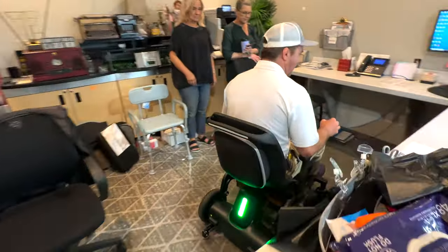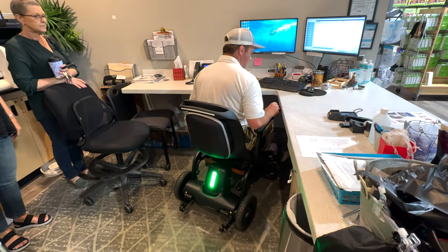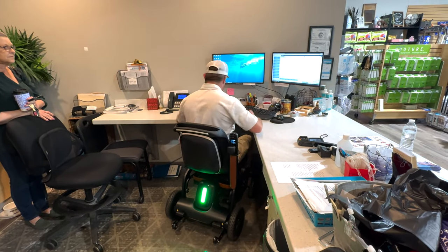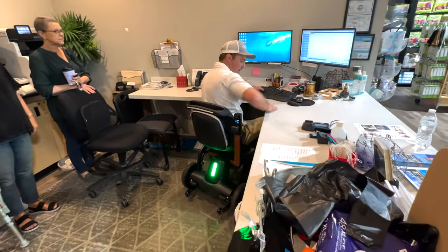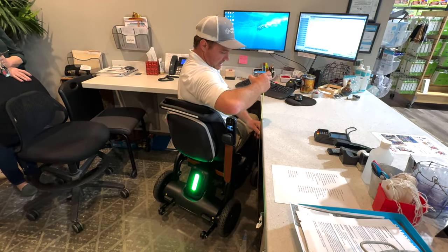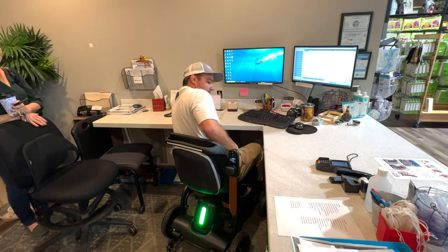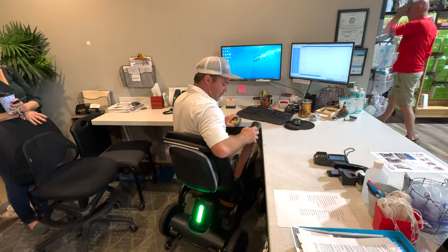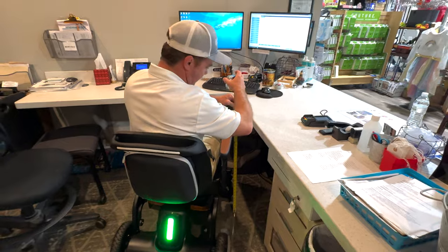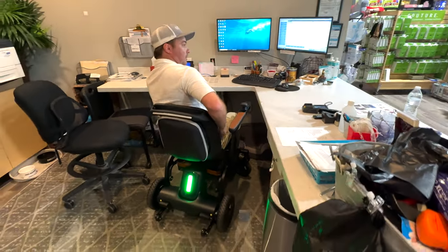Let's see, if you're working, that looks good. You know, I could probably get it there, or I can get this back up and control it once you get used to it. If you're younger and you still have to work, this might be too low. Let's see how low this is. This might not be ADA. This is less than 30 inches, so it probably should have been a little bit higher. To get under the table, you need 31 inches. 32, you're golden. 31, you'll be fine.